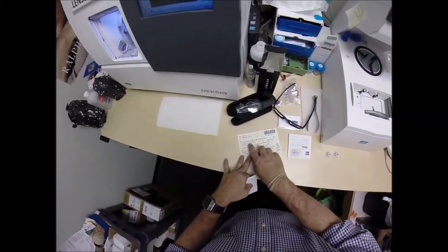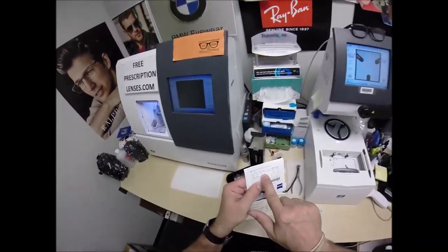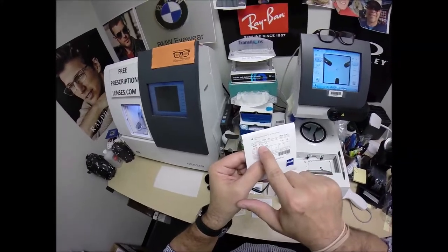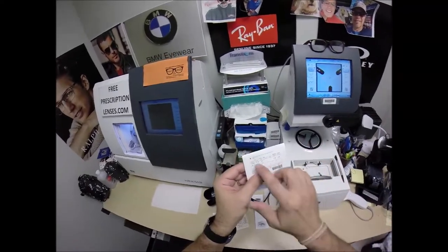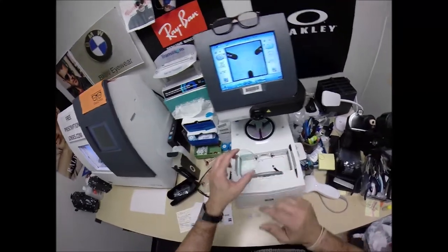Your right eye is plus 50, minus a quarter at 43. It could be written in plus cylinder — yours is on top, which is the minus. It could be plus a quarter at 133, which is 90 degrees away from that, but I'll highlight that in the ink later. I've already put the dots on the lenses.